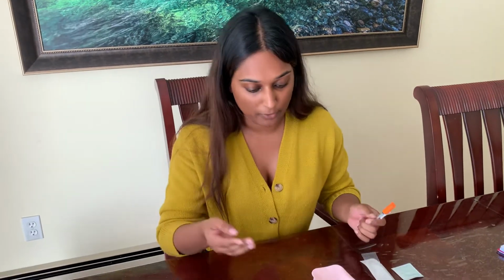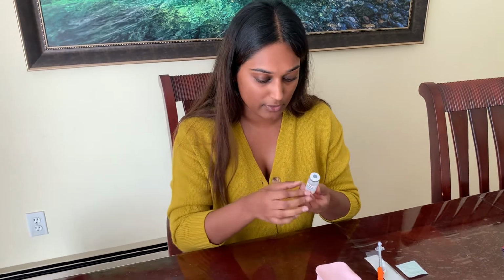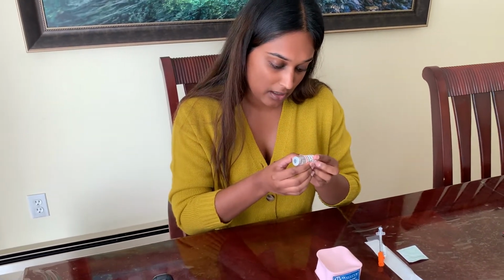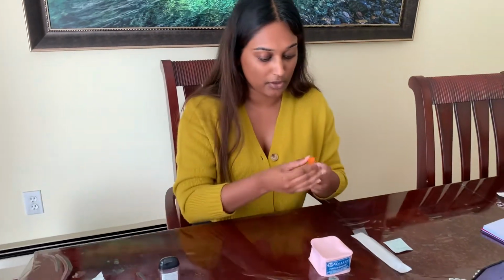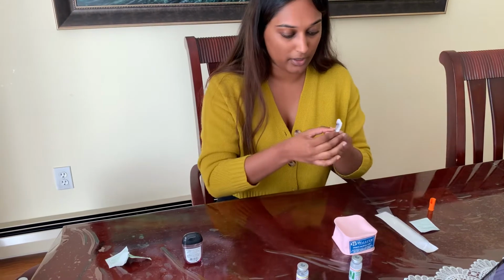Also, like I mentioned before, I would do my checks. I'm checking that this is for the right patient, right medication, and checking the expiry date on the vial itself, and also checking the little sticker that should specify when it was opened, just to make sure that it is still within the 28-day period of when it was opened. And then doing the same check for this one. So I'm going to go ahead, just keeping my cap over here.